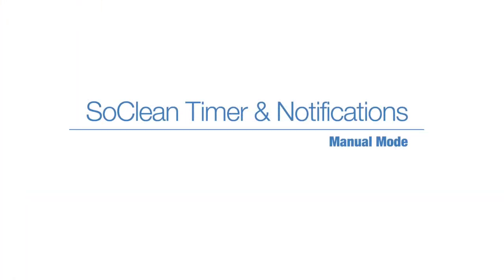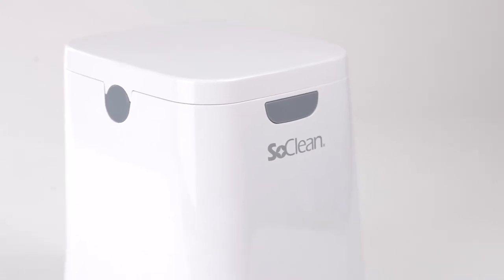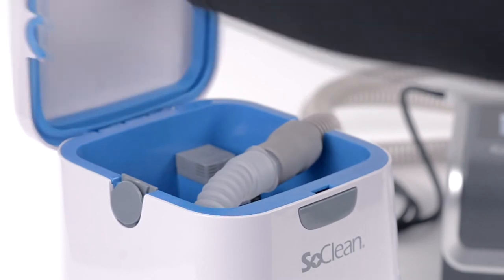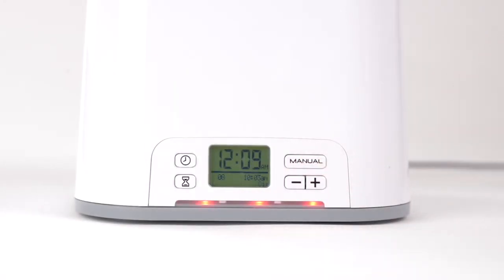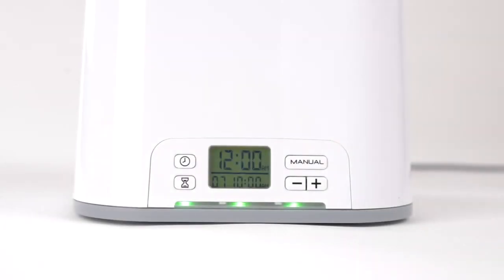Manual mode: when you wish to run the SoClean other than during your scheduled cycle start time, make sure your sleep equipment is in place and the SoClean lid is closed, then press the manual button to begin the cycle. The cycle starts immediately and runs for the set cycle time duration and will not affect your pre-scheduled start time. As usual, wait for the green light before removing your equipment.